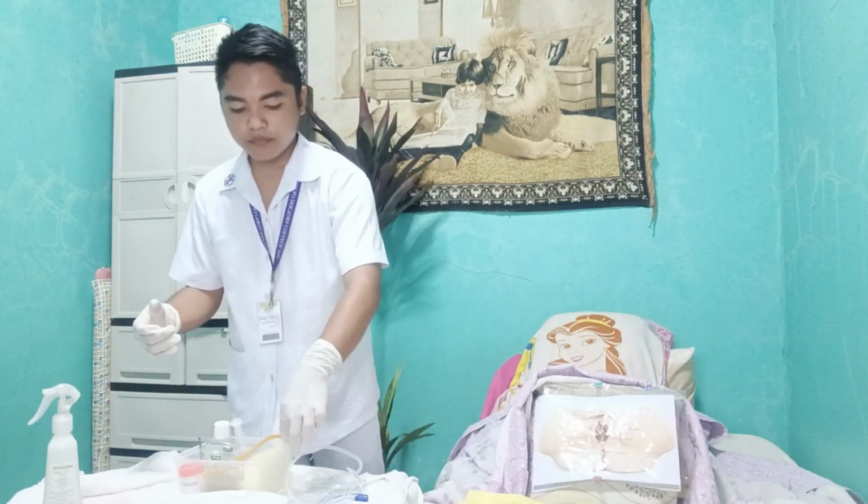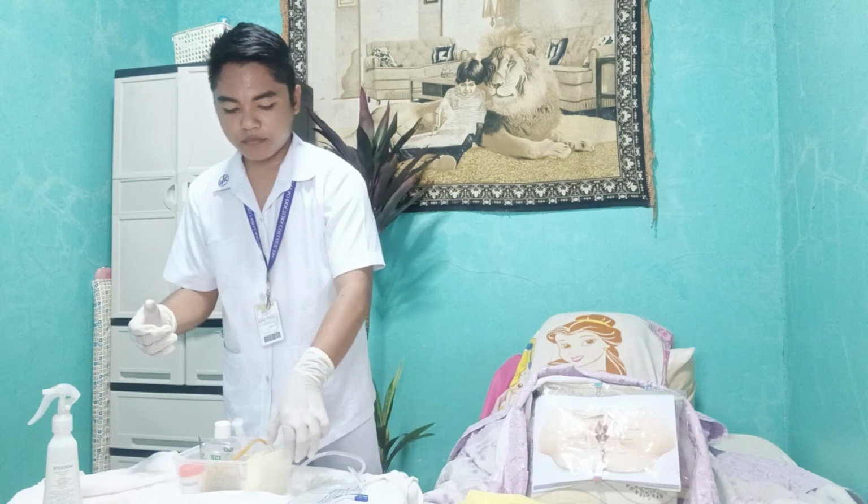After donning my gloves, I'm going to get my eye sheet and place it on my patient.